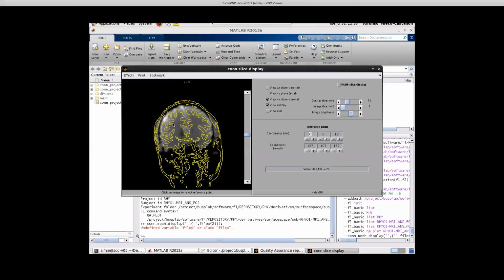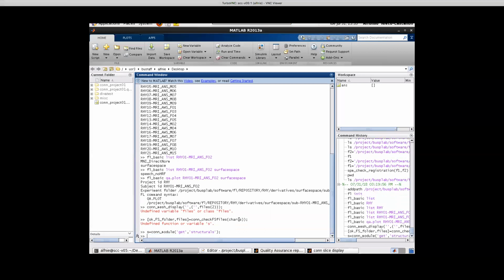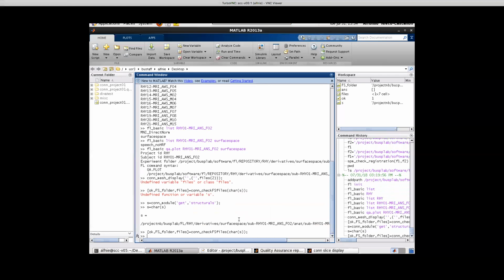So on the structural data, they all already look nice. We already know that. Okay. And so that'll be before you can run this ahead of time, but before any final version of this is done, someone will have gone through and signed off that the FreeSurfer surfaces look reasonable, and determined whether there's some very atypical anatomical abnormality in the subject, or in the absence of that, whether some really atypical thing happened with the reconstruction. So that'll be done.